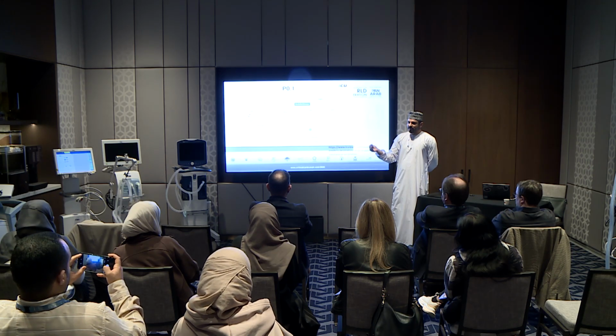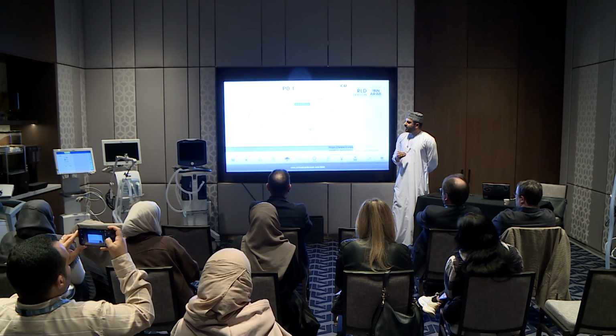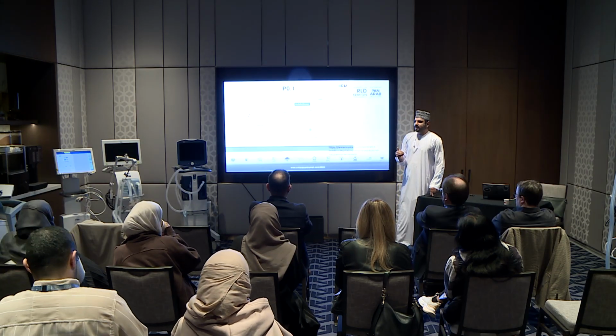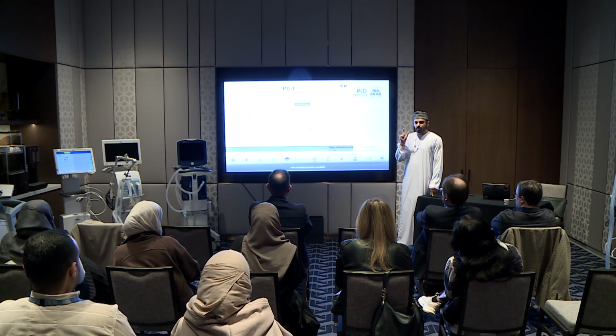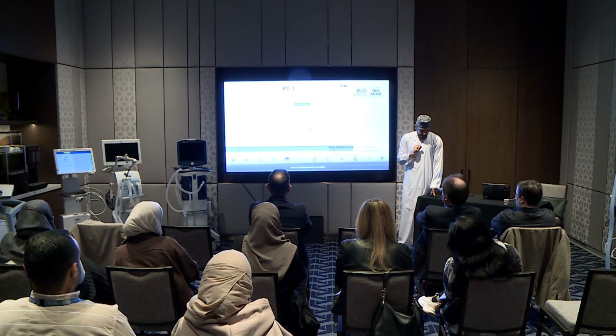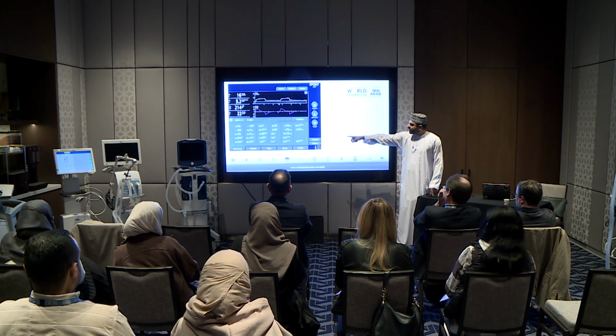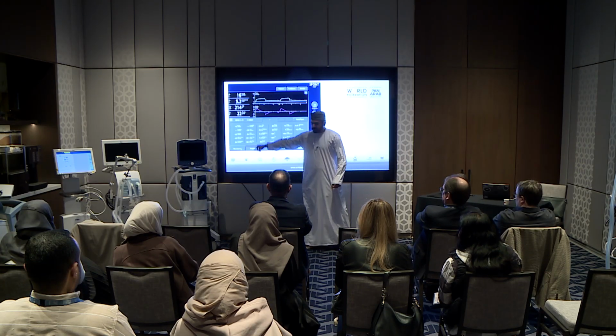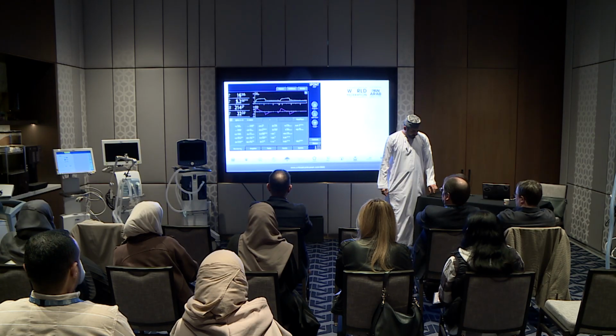the respiratory effort. So it's not affected if the patient's diaphragm is weak or there is a neuromuscular weakness, etc. It tells you more of the neuronal input from the brain. In the Hamilton ventilator, it's calculated automatically. You see it here, the occlusion pressure here is minus 3.9.